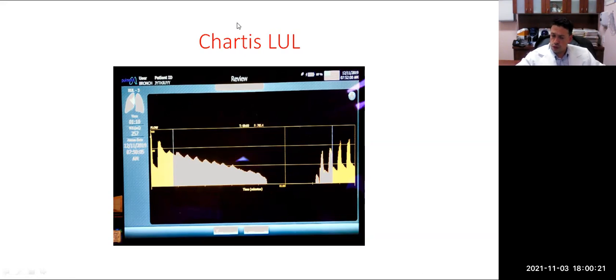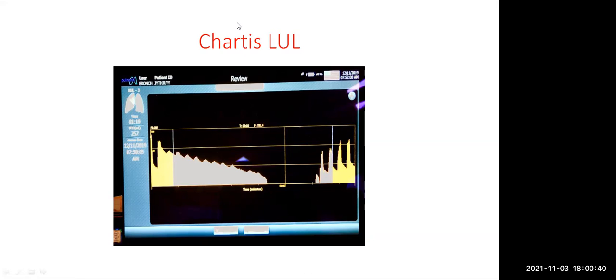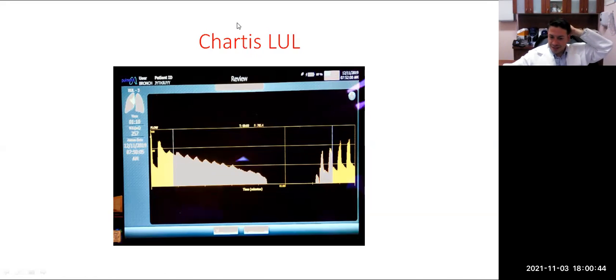And it was a positive trial. And they said, look, our trial was positive. We never bothered with this Chartis. Why do you need to waste time and money and do the Chartis? The one problem is that we don't know the distribution of those fissures. We know they were more than 90%, but were they 100% or were they 91%? Because 100% is very different than 90 in this line of work.